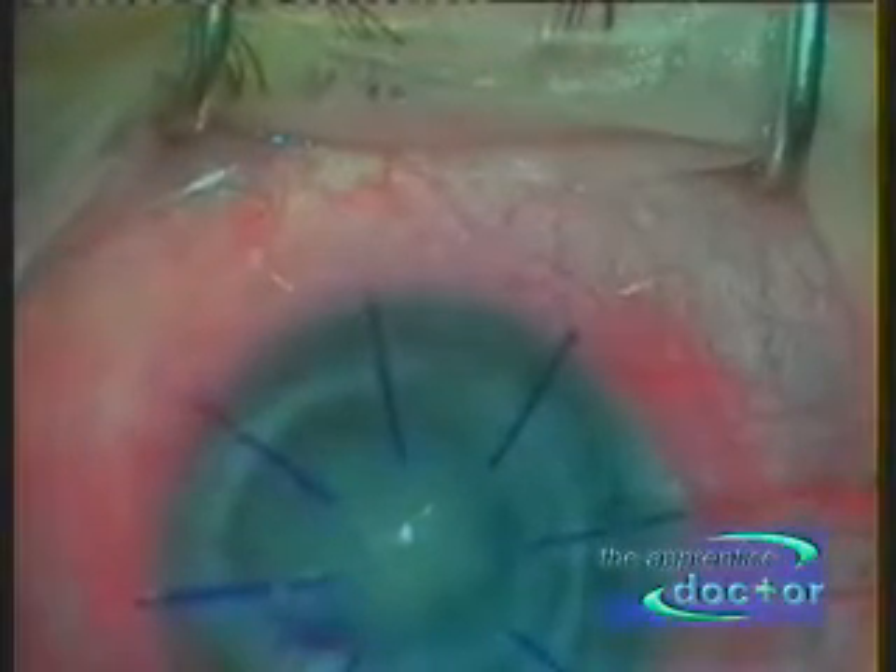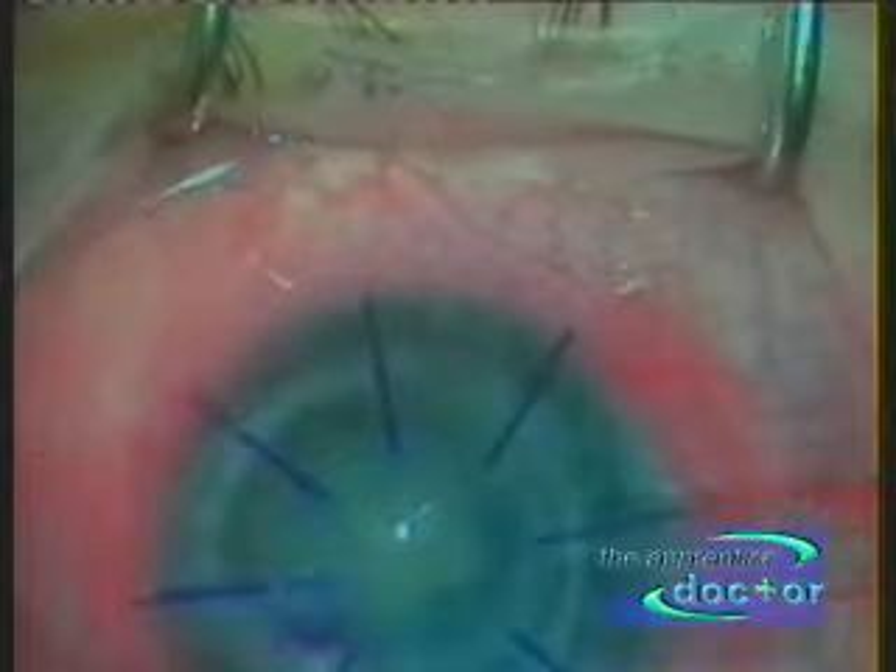The eye surgeon starts by carefully measuring the dimensions of the diseased cornea. This star-shaped apparatus leaves temporary markings on the surface of the eye to guide the surgeon during the procedure, especially when suturing.